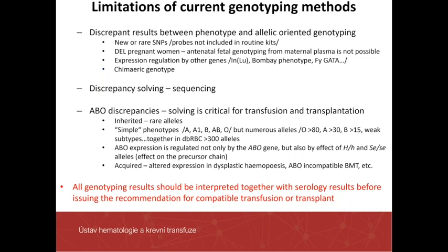These discrepancies could be inherited, those rare alleles which were listed in the dbRBC.